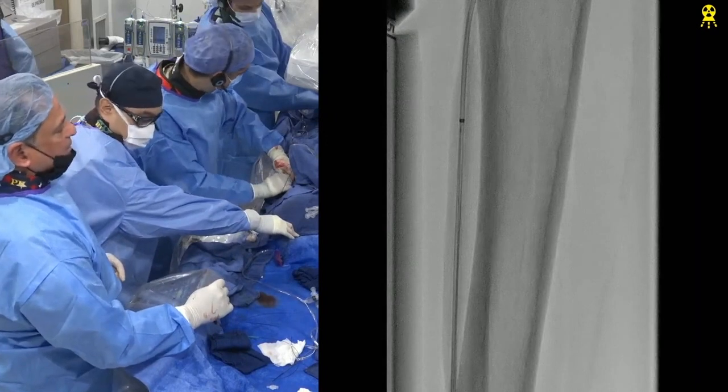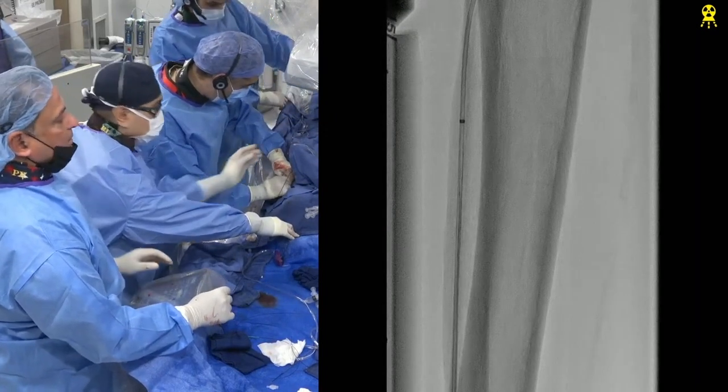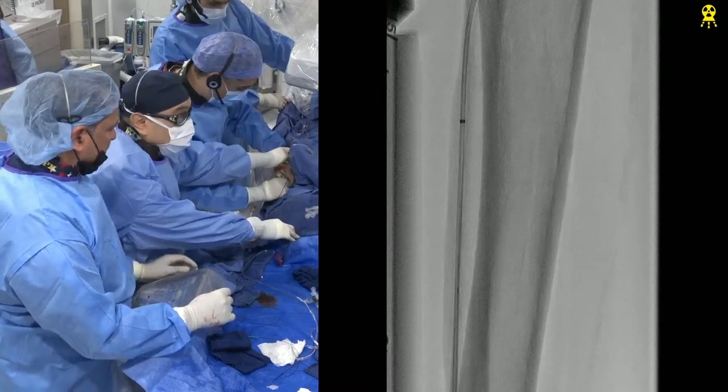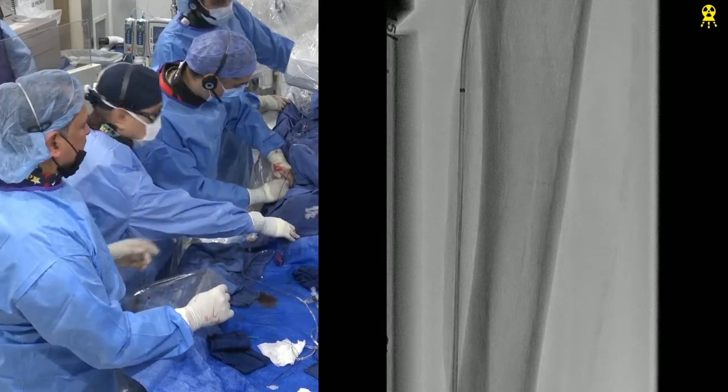I think it's better, remember, if Vishal gets an angle from the top. Okay, let's try to push the catheter up. I don't want to kink my wire. Okay, don't kink it. Vishal, let's just push the catheter up from below. Yeah, leave the catheter there, Vishal. Actually, no, it's almost out. Vishal's doing a great job.